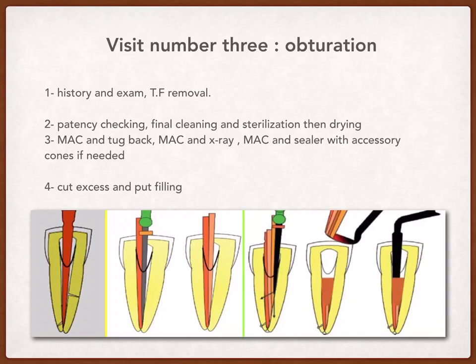After that, we will put a sealer with the MAC and seal it and spread it if it is a lateral compaction technique, and add accessory cones accordingly.